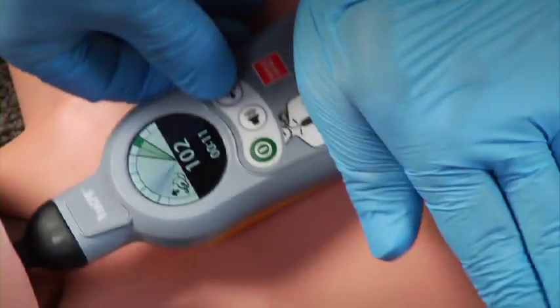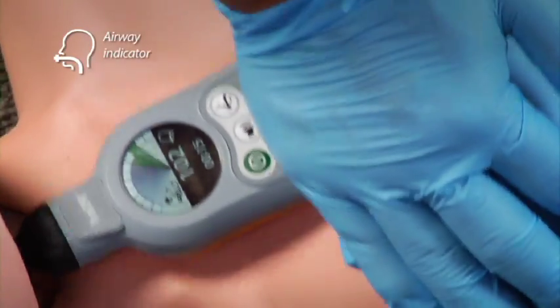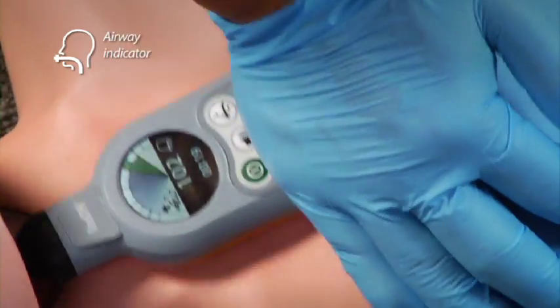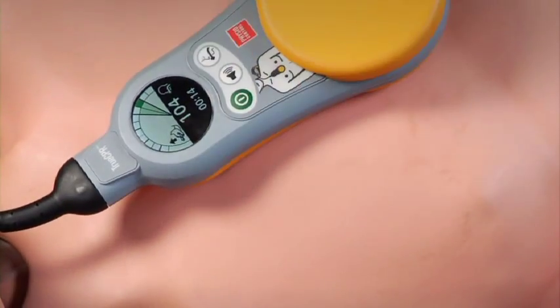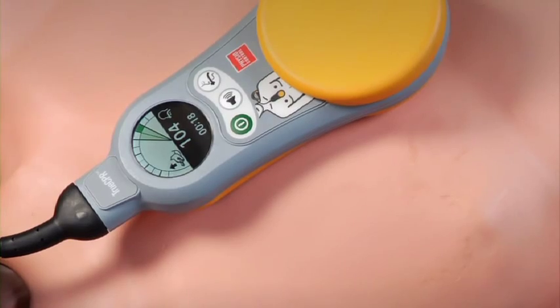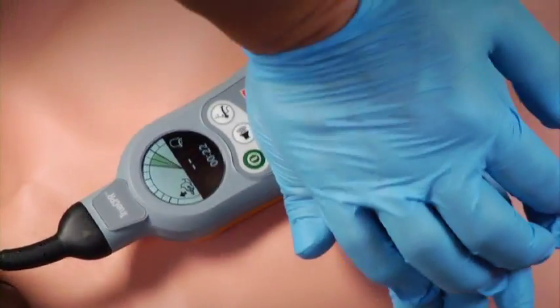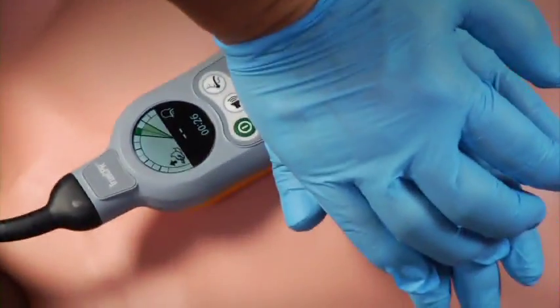If a secured airway is in place, press the airway button to switch to continuous compression mode. This airway indicator appears. In continuous compression mode, there will be no ventilation prompts. Any time you stop compressions, the rate display becomes an inactivity timer. Once you resume compressions, the rate will be displayed after several compressions.